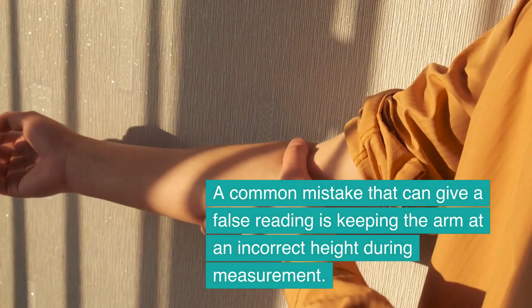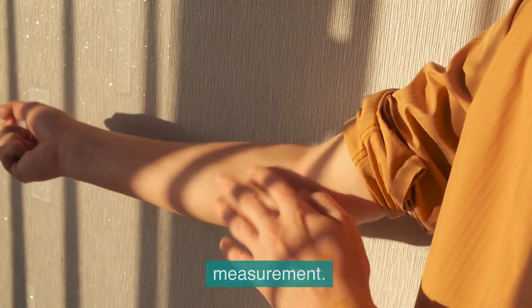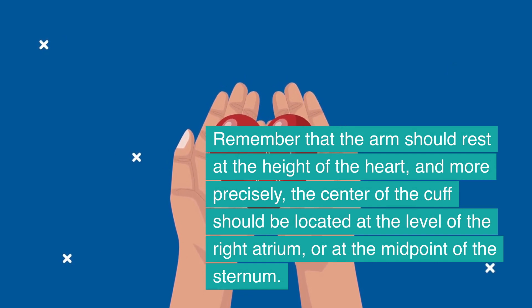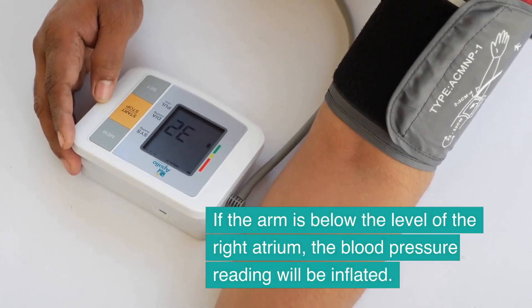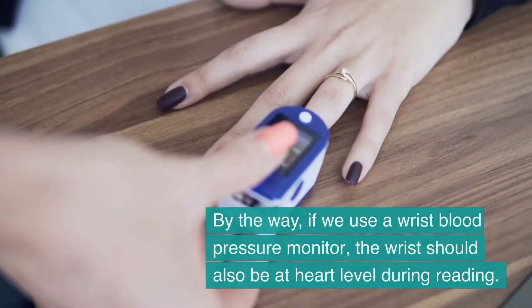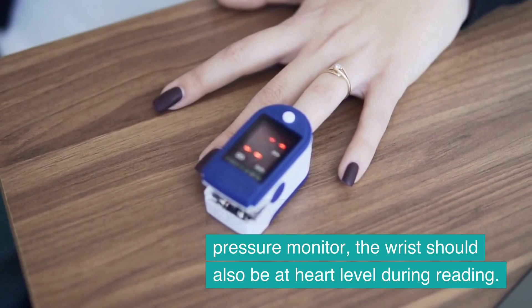A common mistake that can give a false reading is keeping the arm at an incorrect height during measurement. The arm should rest at the height of the heart, and more precisely, the center of the cuff should be located at the level of the right atrium, or at the midpoint of the sternum. If the arm is below the level of the right atrium, the blood pressure reading will be inflated. If we use a wrist blood pressure monitor, the wrist should also be at heart level during reading.